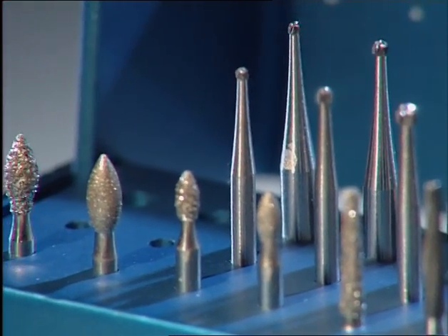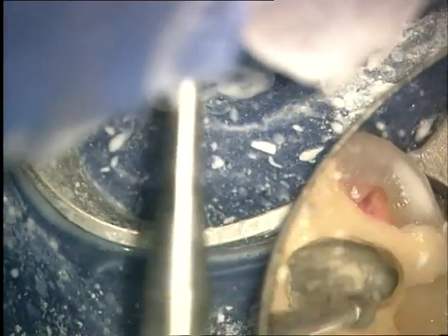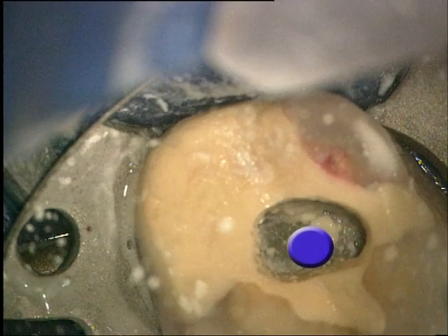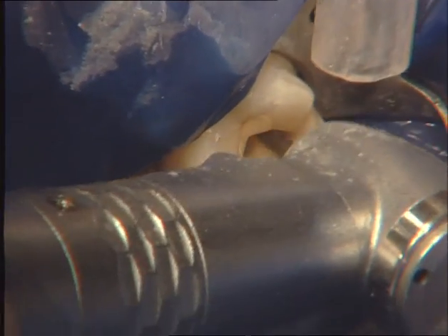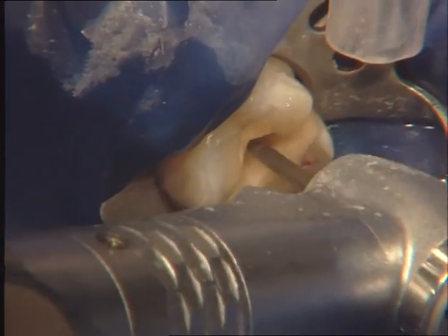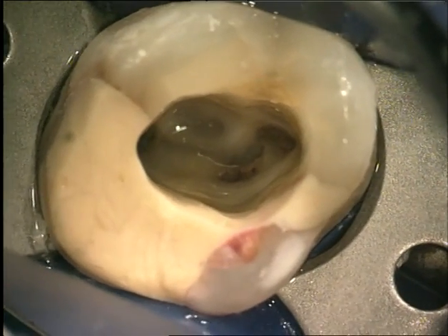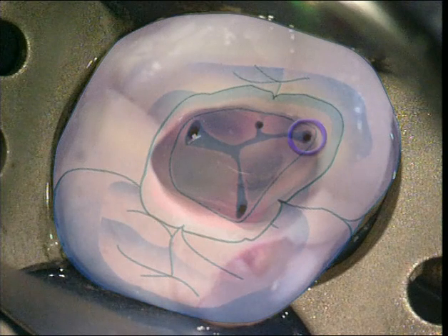The initial penetration of the pulpal roof is localized in the center of the central groove, with the bur inclined slightly towards the mesiobuccal cusp. In order to get a straight line access to the mesiobuccal root canal system, the walls of the access cavity should be inclined slightly towards the buccal and the mesial. In upper molars, the typical outline of the access cavity looks rhomboidal.